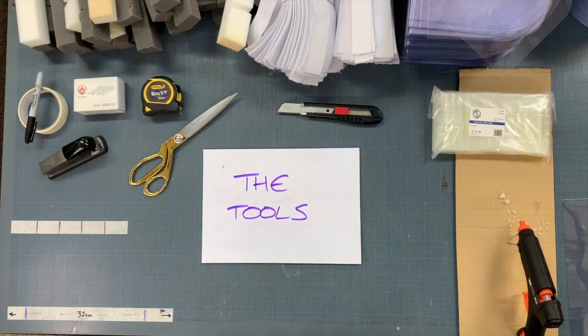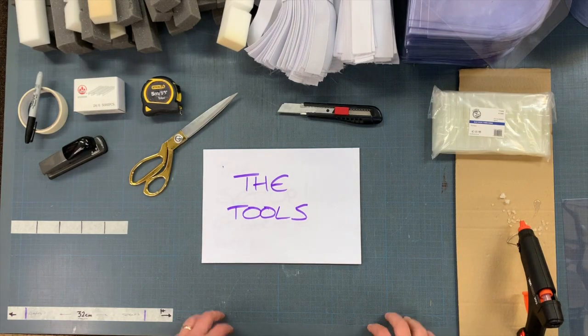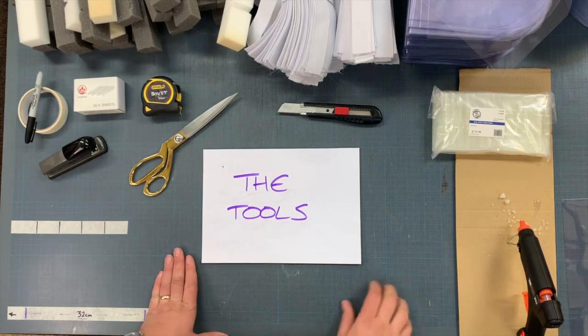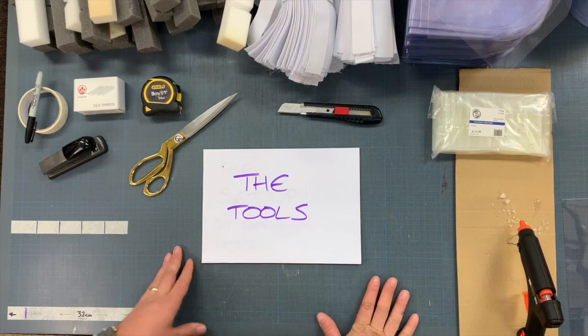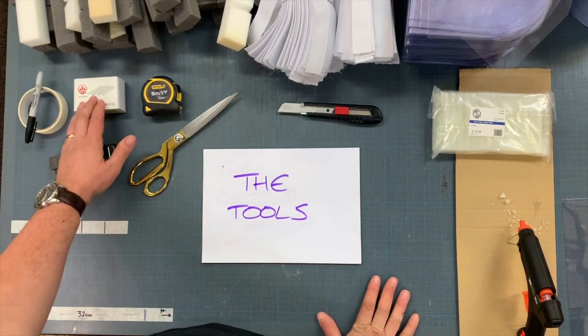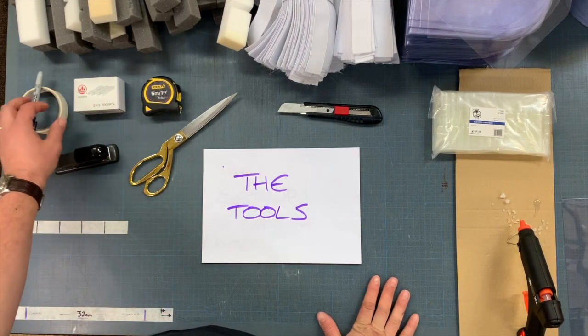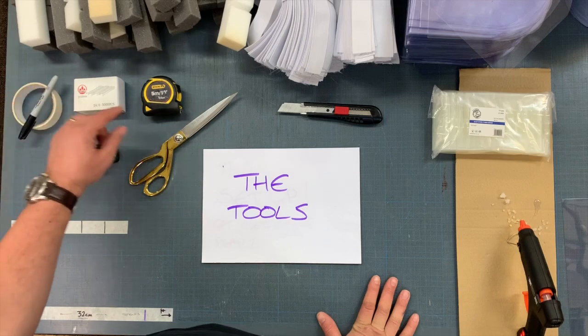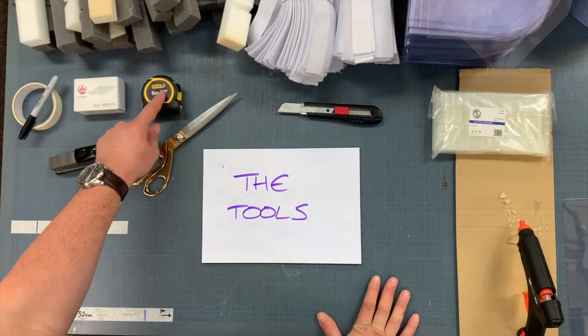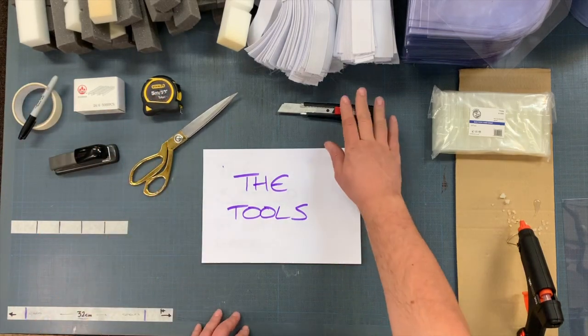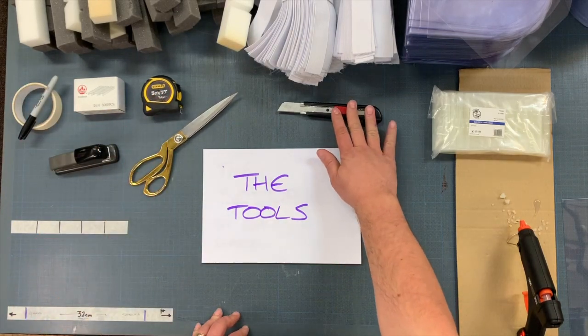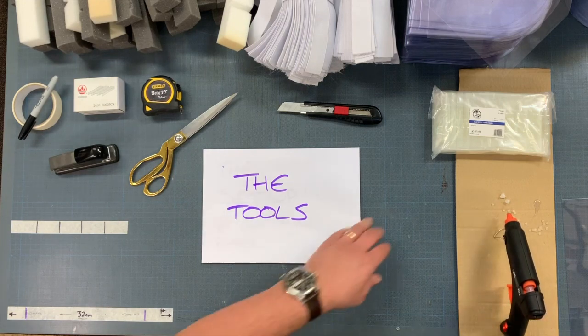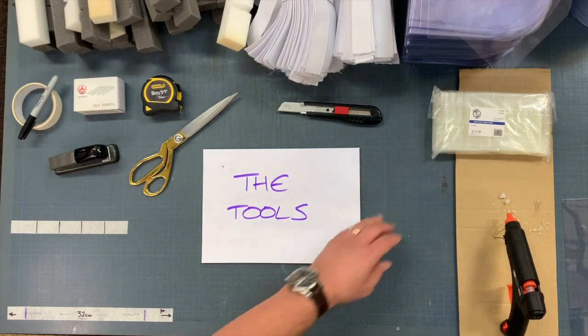First, get all the tools you need ready: a good cutting mat or cutting surface, a stapler with staples, masking tape and a pen, tape measure, a good pair of scissors, a Stanley blade, and a glue gun with glue sticks.